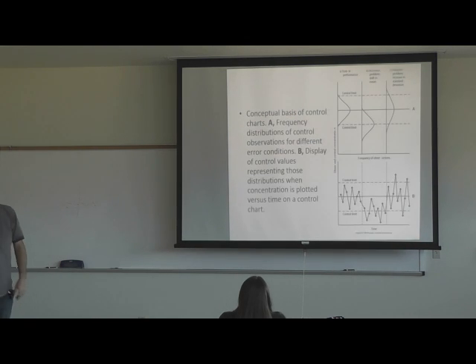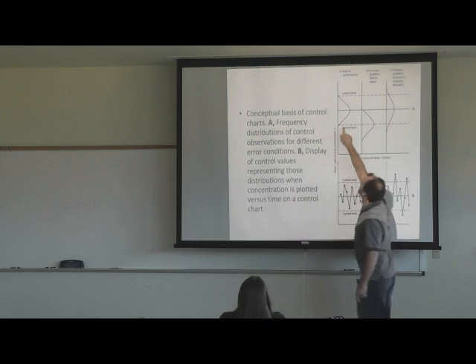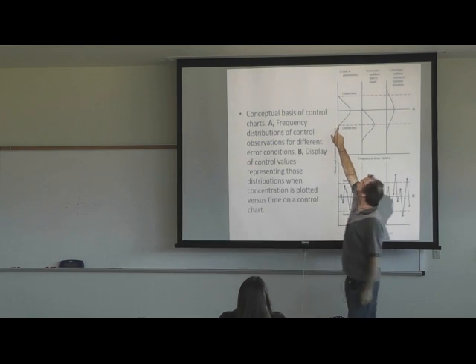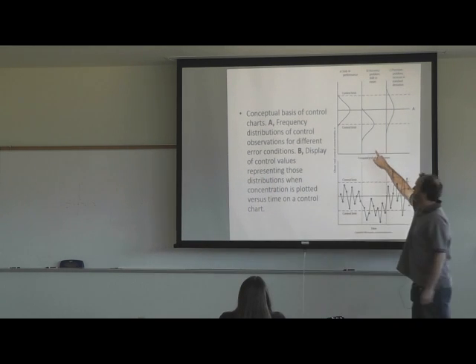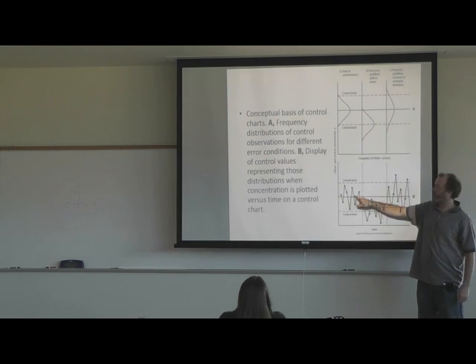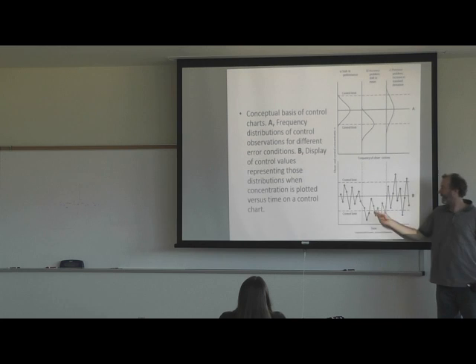And you get these types of graphs, right? Stable performance should show you distribution around the control limits like that, where you're going to have some normal values outside of the range. This represents a shift in the mean, right? You plot the control data, and normal data is going to have a distribution like that. It looks similar to this as you go through the days.